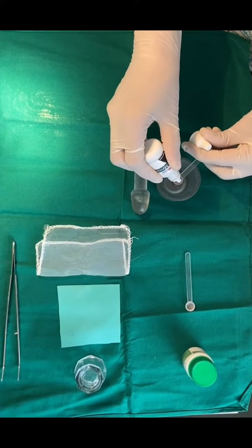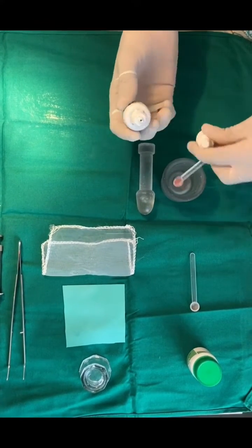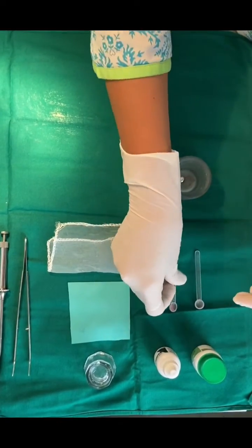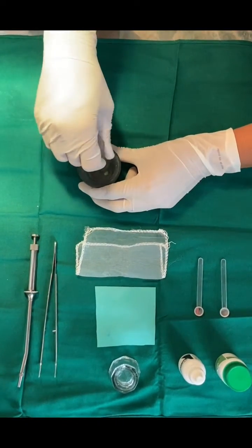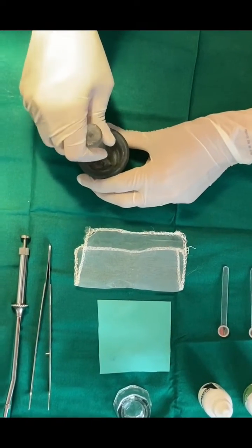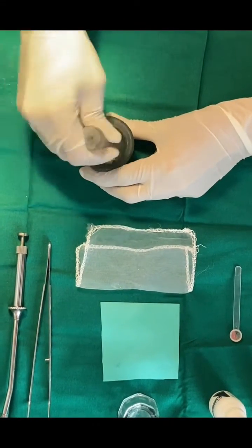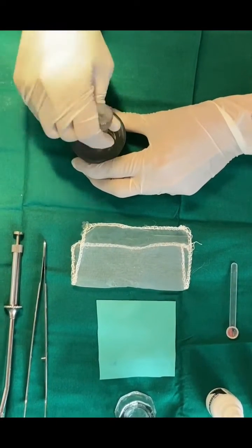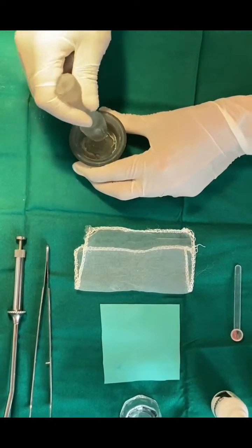Trituration can be done by two methods: manual and mechanical. Here we are showing manual trituration using mortar and pestle. Trituration aids to remove the oxide layer on alloy particles and wet each alloy particle with mercury. Trituration is done till the mercury and alloy are properly mixed to produce a plastic mass that is shiny and homogenous, which is achieved in about 20 seconds.